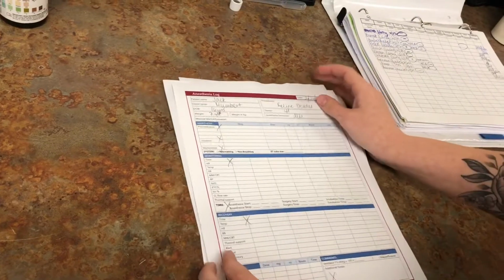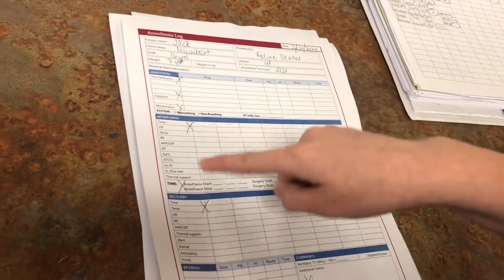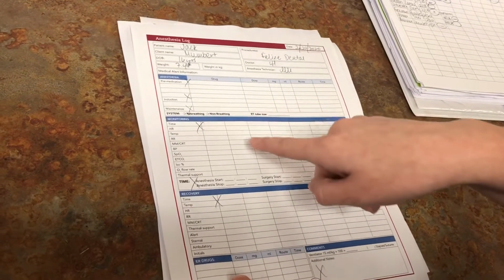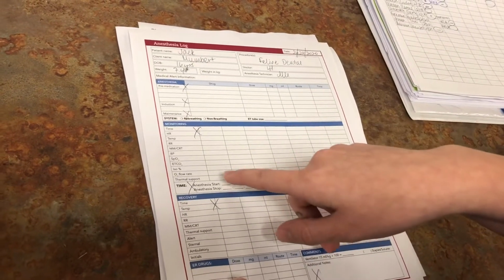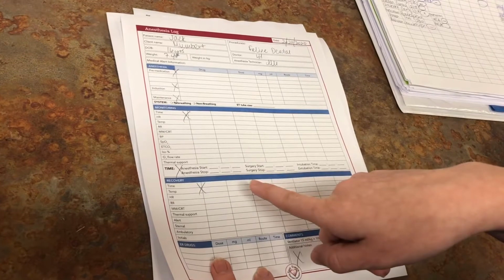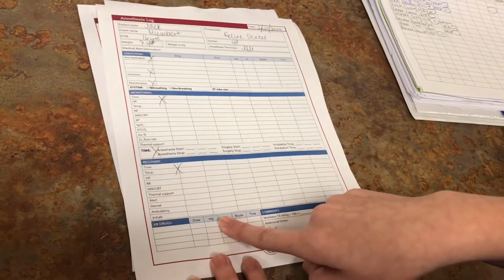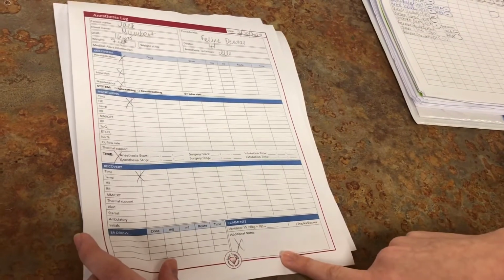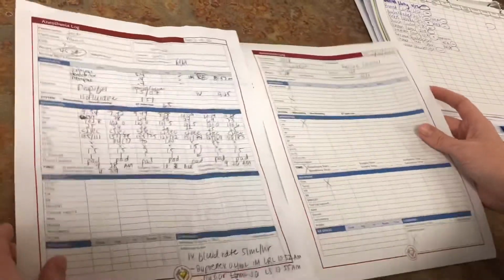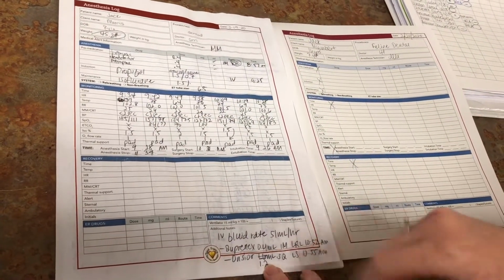We have our anesthesia monitoring log where we have their information, what they're coming in for, and then we mark these main categories here: drugs that we use to induce them, monitoring all of their vital signs while they're under anesthesia. We like to keep track of when surgery starts, when anesthesia starts, and then vice versa, when surgery stops and when anesthesia stops. We also keep track of their recovery, and then any additional notes is where we put IV fluid rate, pain injections, that sort of thing. So I included an example of a patient that was in last week where we monitored and then wrote down some additional notes down here.